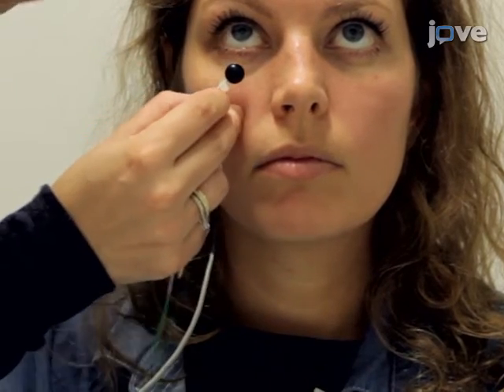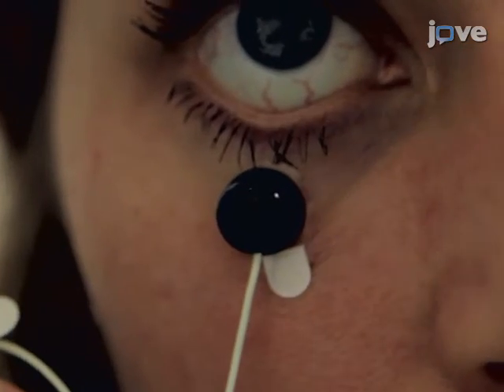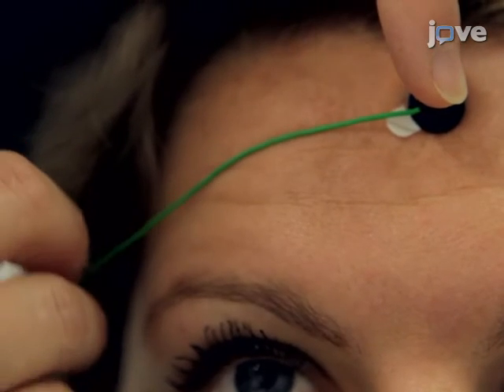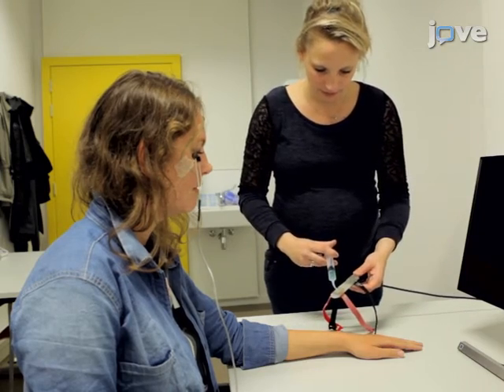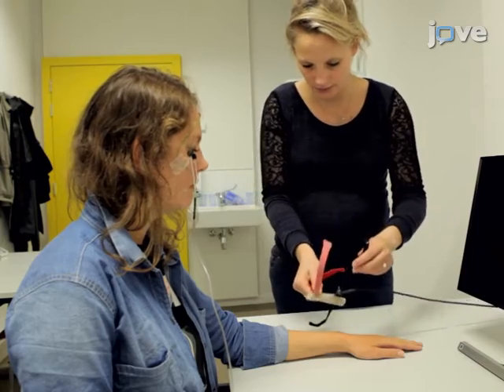Attach one of the electrodes below the lower eyelid of the eye in line with the pupil in a forward gaze. Attach the second one about 1.5 cm lateral to the first, following the curvature of the lower eyelid. Next, attach a ground reference on the forehead. Apply a drop of conductive gel onto the shock electrodes and attach them onto the left upper wrist using a nylon Velcro strap.